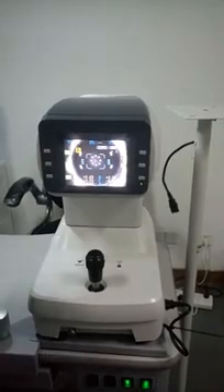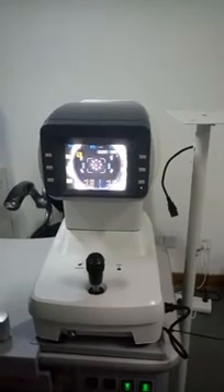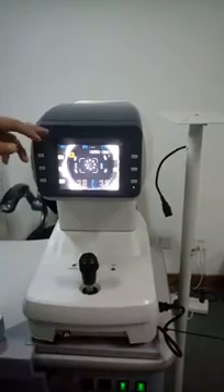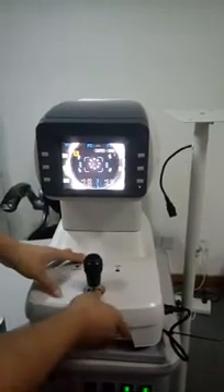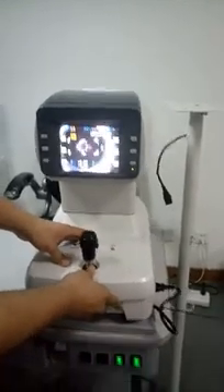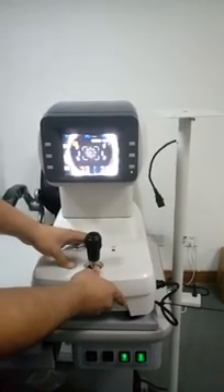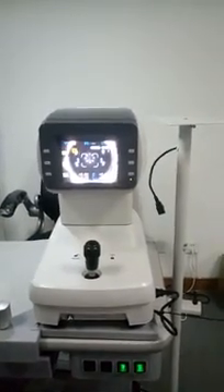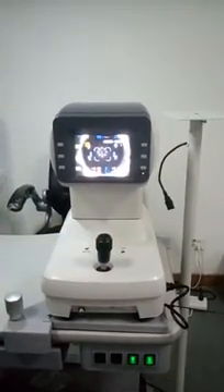It's very convenient for rookies. It also features true color display and a log function. After you find the correct position, you can lock it, so the result will be more precise.